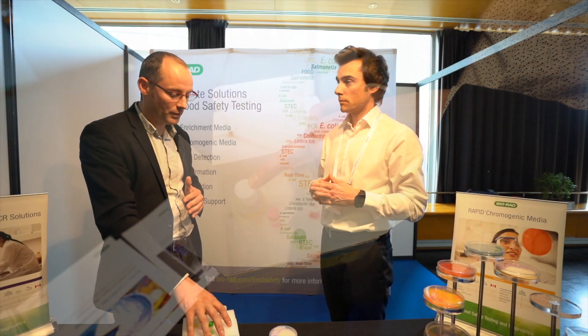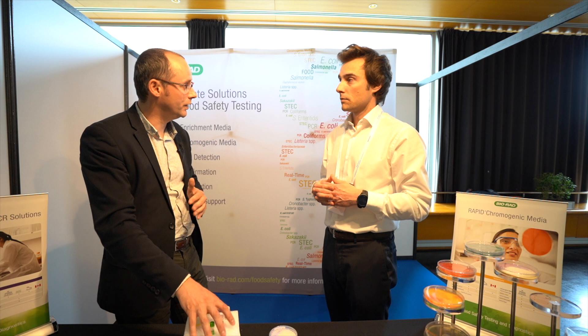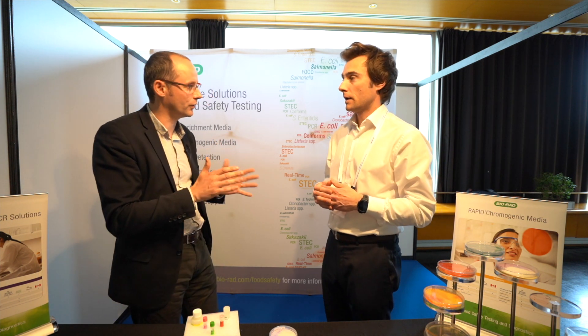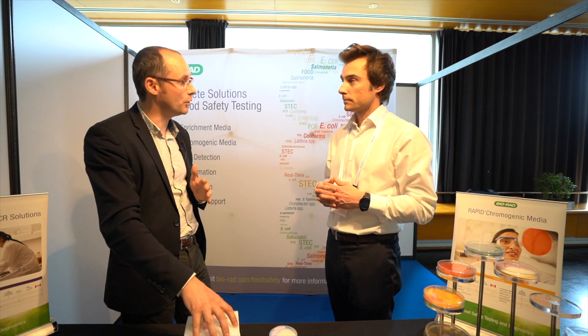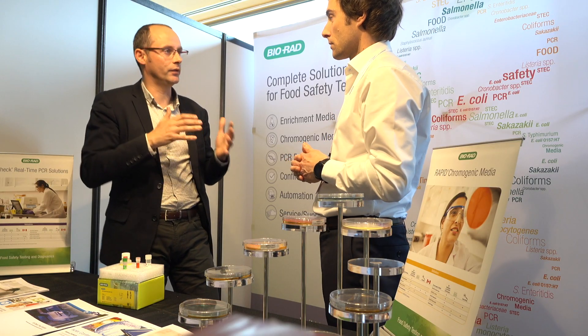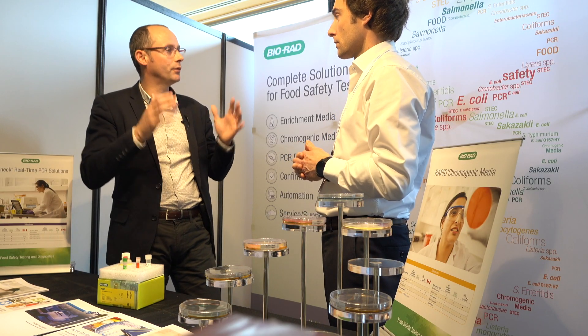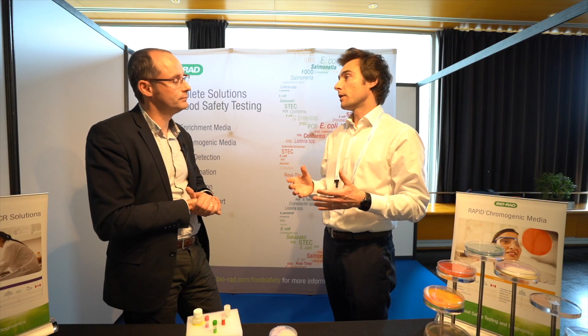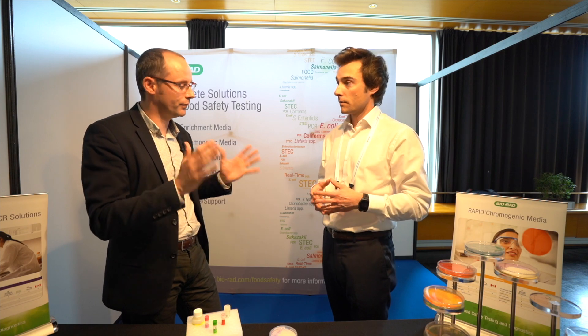Also very important: the storage. It's stored at 4 degrees Celsius — you are not using frozen minus 20 Celsius. And for shipment, it ships at room temperature. So very easy to use. The time to result: you have the same enrichment of 16 to 22 hours, but for the detection it's only less than two hours. So you are winning a day — you have the complete result in less than one day.